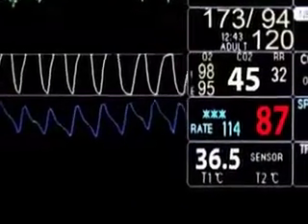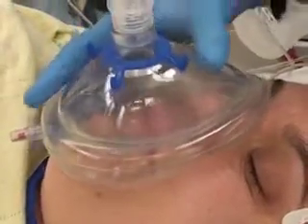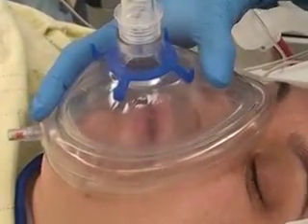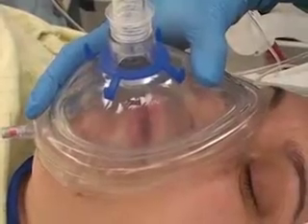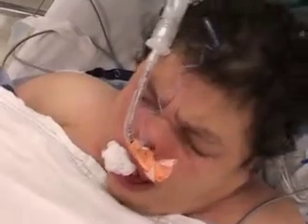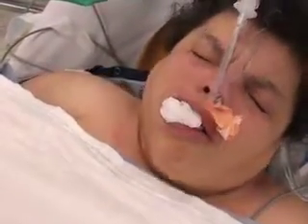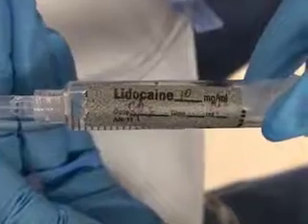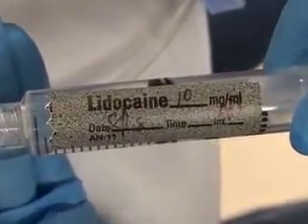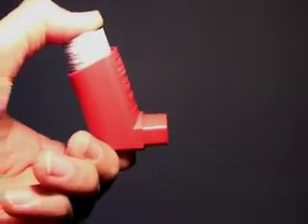Although few extubation-related complications are life-threatening, hypoxemia is the common pathway to severe complications. In the period immediately after extubation, early respiratory insufficiency may be caused by poor ventilation or residual neuromuscular blockade. Bronchospasm and severe coughing can also impair adequate ventilation. Both conditions can be treated with topical or intravenous local anesthetic agents, intravenous opioids, or bronchodilators as indicated.